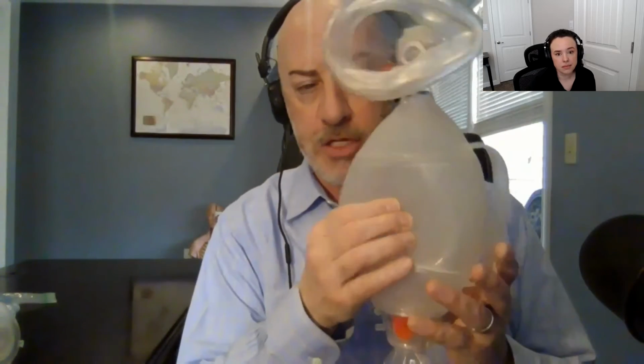Let's talk about the rate issue, unless you have any questions, Ashley. So the rate issue is, as I said, hyperventilating the patient by doing this and breathing for them at 40 times a minute. And the reason that's bad is because the faster you ventilate for somebody, the more CO2 you're breathing out. And if we upset the CO2 balance, that can affect your body's pH and can make somebody more acidic or less acidic, which can be bad for the patient. So we do have to be careful about how fast we're squeezing. Plus, the faster we squeeze, the more air we're putting in, and that could affect blood return to the lungs and things like that.